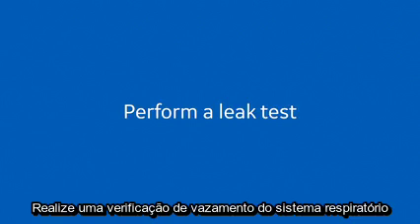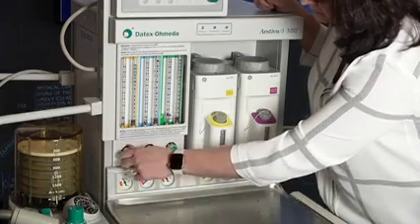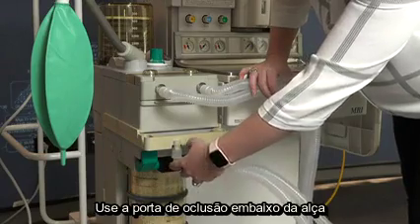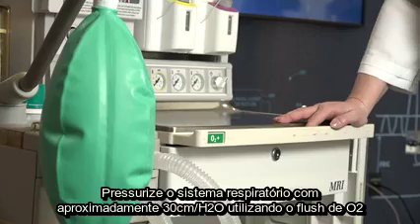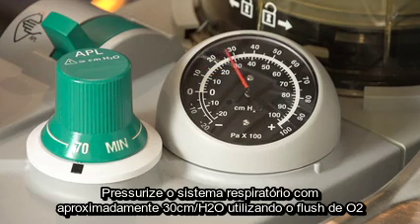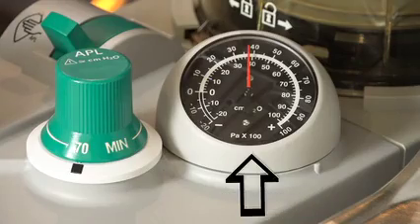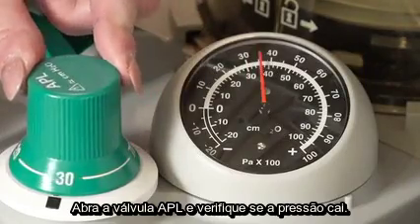Perform a leak check of the breathing system. Set all gas flows to zero. Close the APL valve and occlude the Y piece using the occluder port underneath the handle. Pressurize the breathing system to about 30 cm of water pressure with the O2 flush. Ensure that the pressure remains fixed for at least 10 seconds. Open the APL valve and ensure that the pressure decreases.